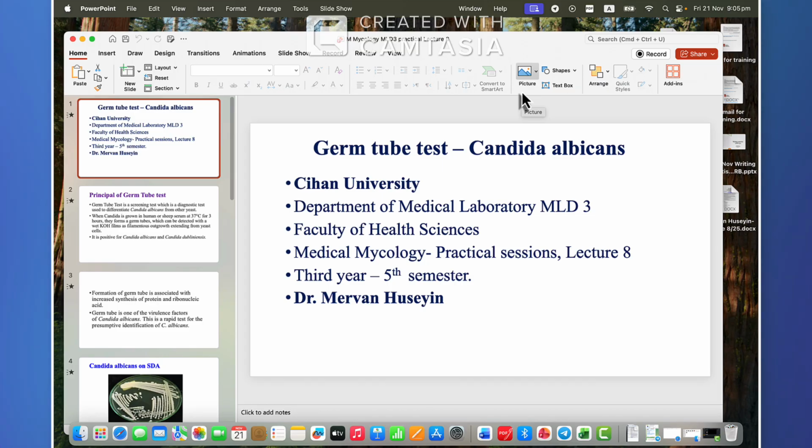This is Cihan University, Department of Medical Laboratory, fifth semester in the Medical Laboratory Department. I am Dr. Marwan Hussein and I'm going to present the practical session, lecture 8, for you. Today is the germ tube. Germ tube in Candida albicans.